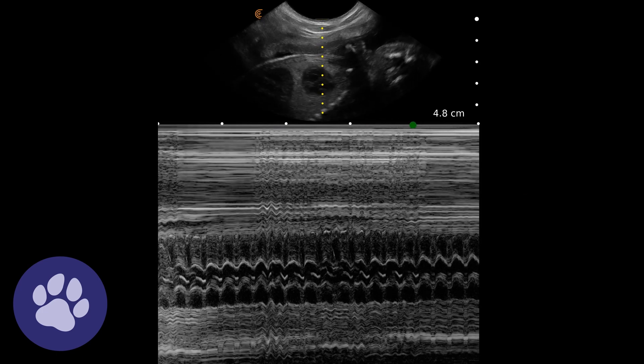Here we've reduced our depth to optimise for this heartbeat, so we can see the movement of the heart along here. Most machines will have a setting where we can record the fetal heart rate.